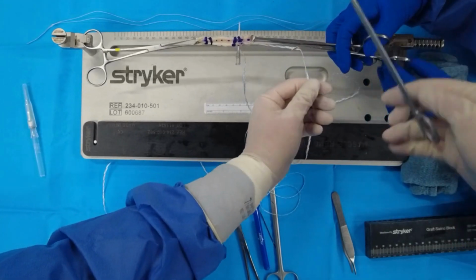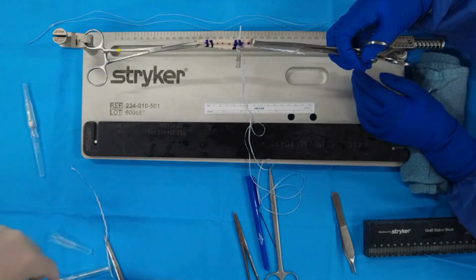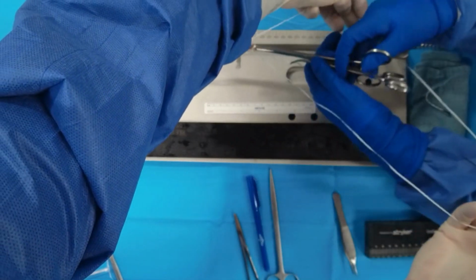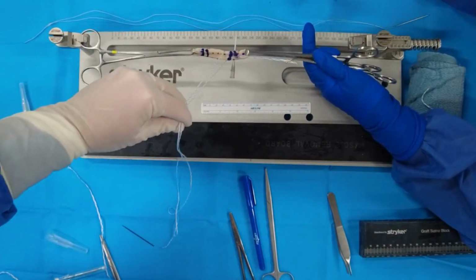The strategy behind incorporating the tape is really due to the underlying morphology of the quadriceps fibers, as they tend to run relatively parallel. And this was done in an effort to improve fixation, decrease creep. However, again, with this technique, I think it's really much less of a concern.